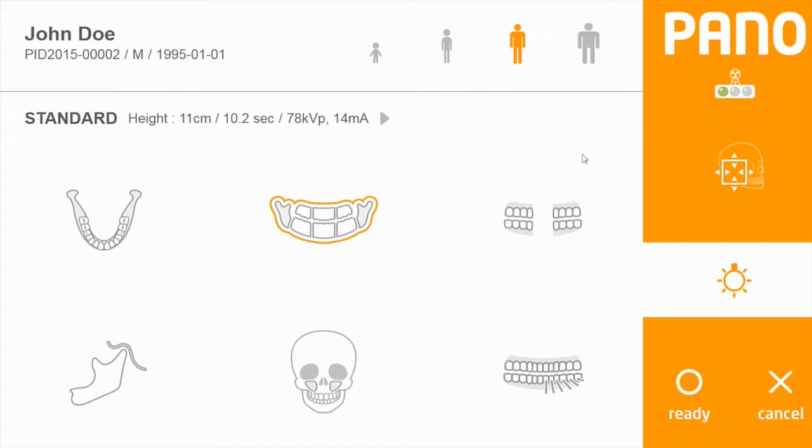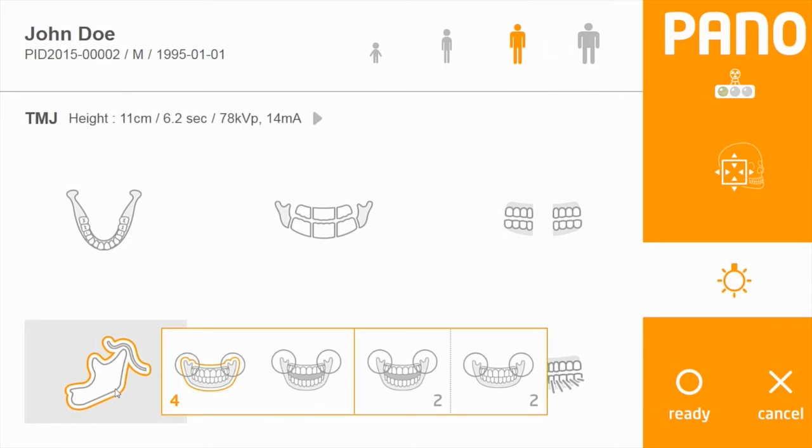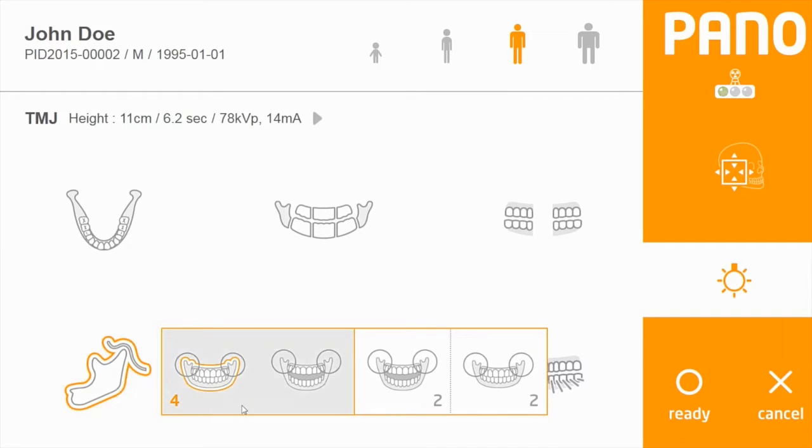To the right is the external bite wing option. Below the standard panoramic option is two-dimensional TMJ acquisition. This lets you take one or two rotations around the patient.